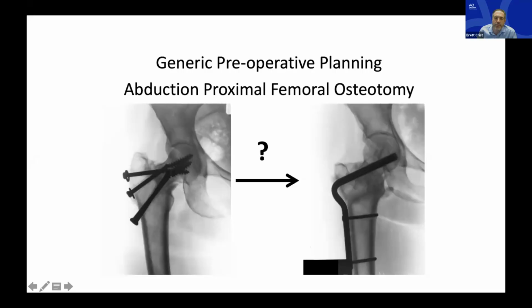While he's getting his screen share, Joel, I noticed that you had your extremity alignment series without blocks under. If you see them before you get the extremity alignment series, and you notice there's a leg length difference, do you ever try to block them out first to level their pelvis, just so you can get a better overall mechanical axis evaluation?